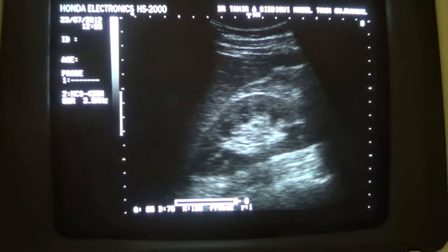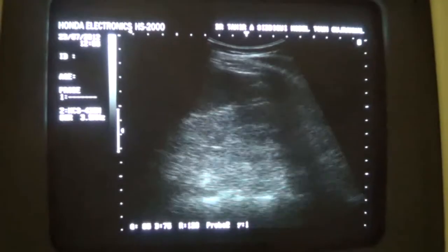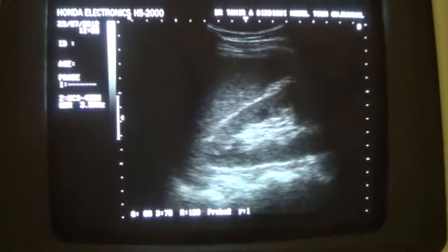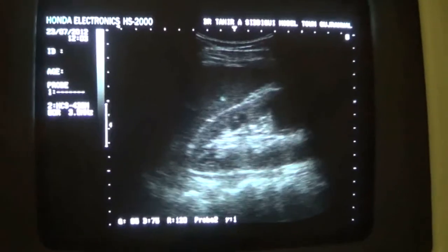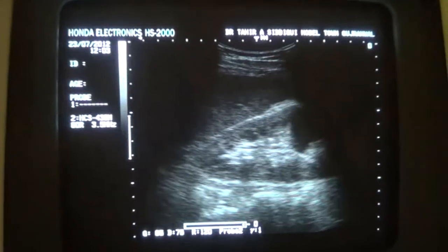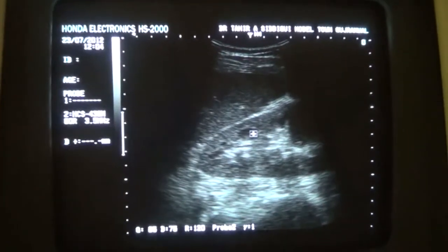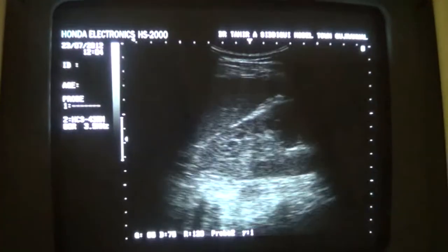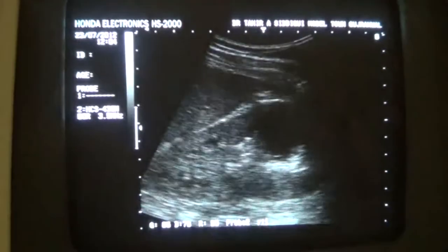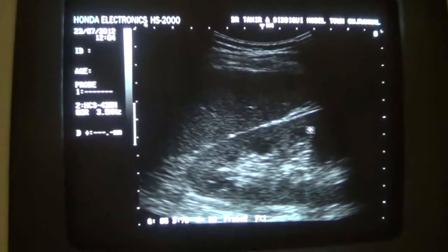Now going towards the left kidney. Again you see that the pyramids are significantly prominent. This is a pyramid — prominent. You can see that the same prominence of the pyramids is present here as well.